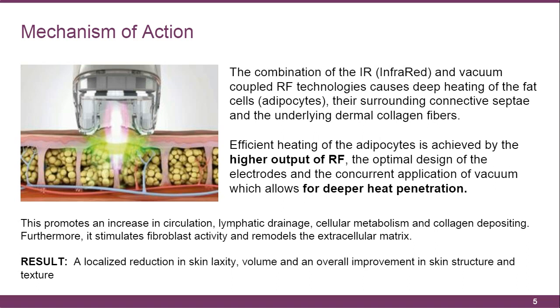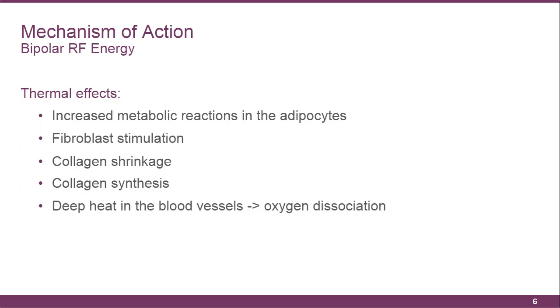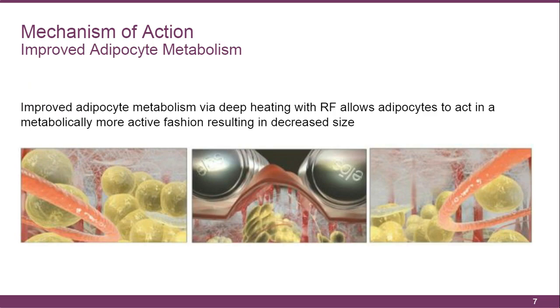So what the bipolar radiofrequency, as we said, is doing is that direct hitting on the adipocytes, but of course, that collagenesis and stimulation of fibroblasts, plus the improvement in the blood supply. So we're getting a vasodilatation, and we're going to improve the circulation in the area. And as we can see here on this image, of course, with the mechanism of action of the adipocytes will improve. And as we heard before, again from Dr. Hamish, the adipocyte tissue is obviously very important in regulating the whole body energy, and of course the glucose homeostasis through this double function at organ and systemic levels.